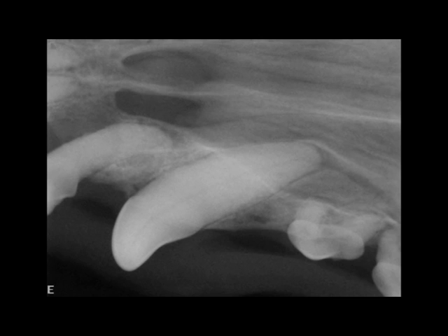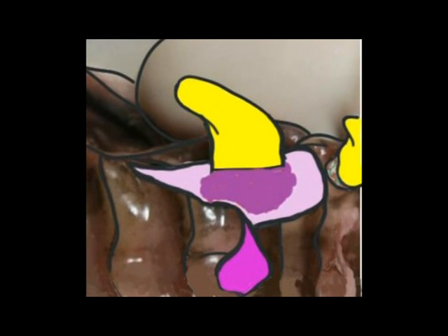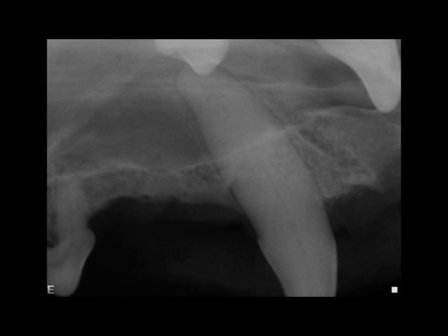As you can see in this image, the palate is cut and this allows the surgeon to see the damage underneath the soft tissue of the palate. Here you can see where the bone should be, and the pus and diseased tissues have been cleaned away. Special materials are used to fill the pocket and sometimes to carefully cover the area. A post-op x-ray is taken showing bone substitute materials in the pocket of lost bone — look at the area outlined in yellow. This is the bone substitute material. The body will use this as scaffolding to create new bone and will stop other tissues that do not develop into bone from invading the area.